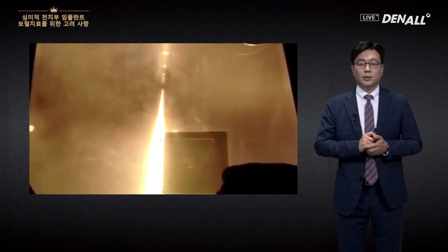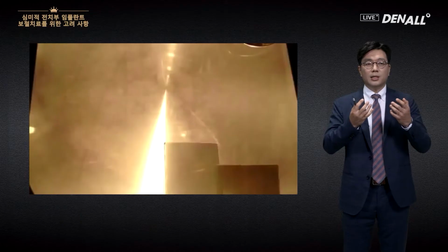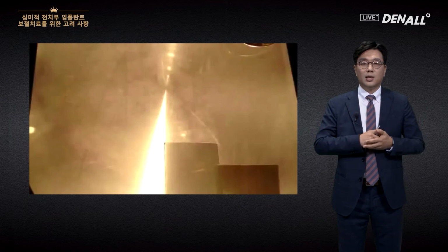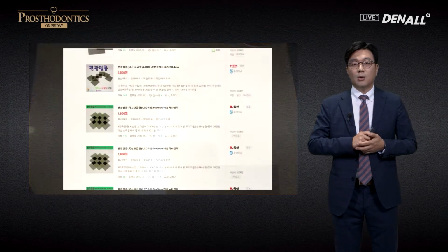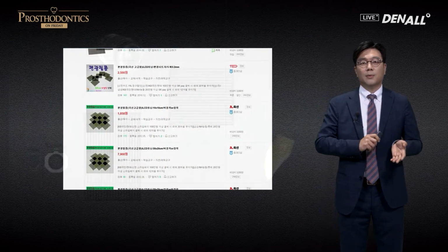Polaroid film is used. There is a slit on one side. If they are perpendicular to each other, the reflective lights cannot pass through it. So, on the flash side and the lens side, you attach the film in a perpendicular way. In selecting a shade, then the color will be more stable. The Polaroid film is very cheap.